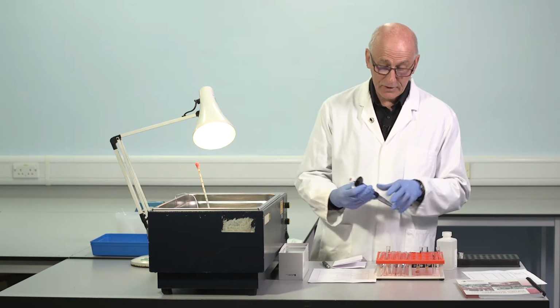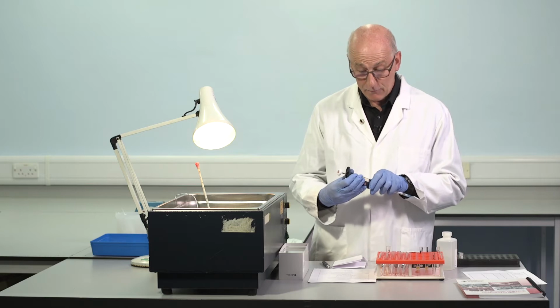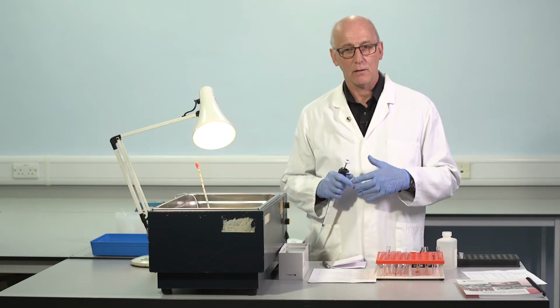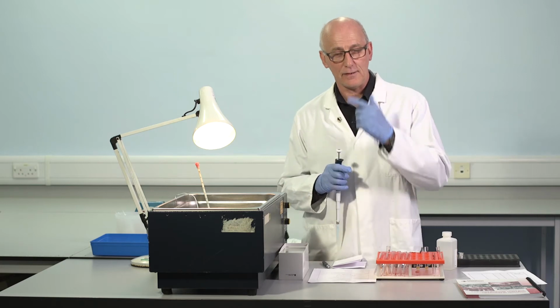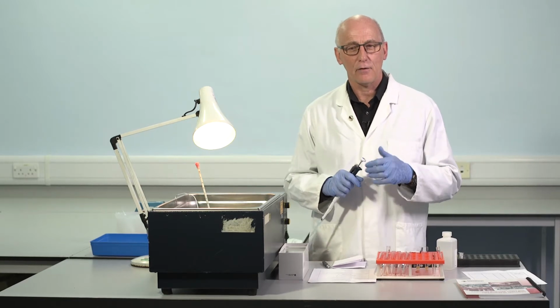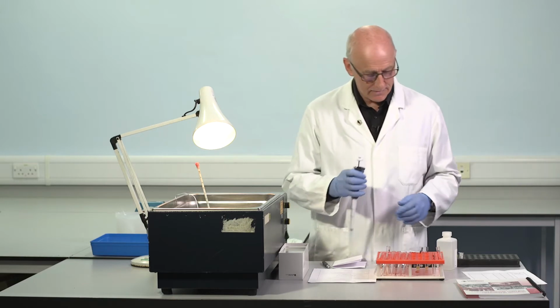For this particular reagent set that we're working with, I know from past experience that dilutions of 1 in 10, 1 in 20, 1 in 40, 1 in 80, 1 in 160, these kind of dilutions are appropriate for use in this assay. We'll make 3 dilutions of the standard to construct our initial standard curve, and so we'll begin with dilutions of 1 in 10, 1 in 20, 1 in 40.